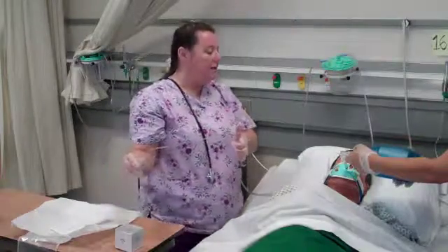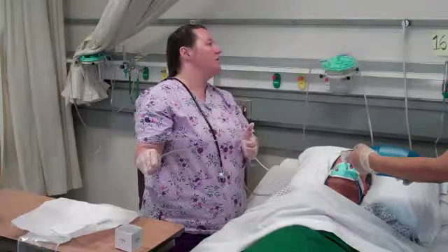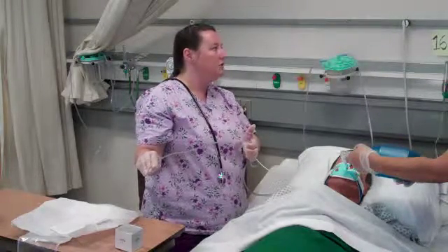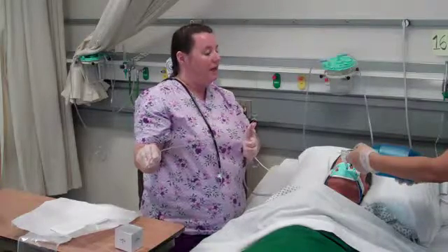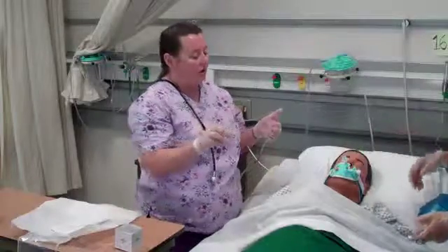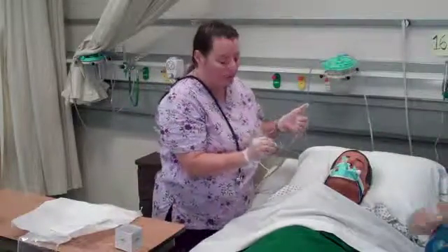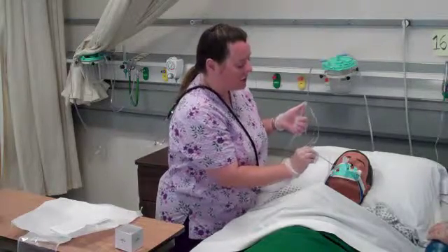I see that he appears to be breathing easier, less agitation. Looking at the monitor, his O2 sat has returned to baseline now. Heart rate has come back to a baseline level now, and Kathleen can go ahead and put the patient back on the ventilator source. Now I want to go ahead and assess my patient's oral mucosa to see if it would warrant any kind of suctioning of saliva and secretions inside.